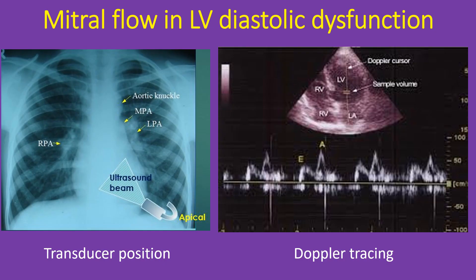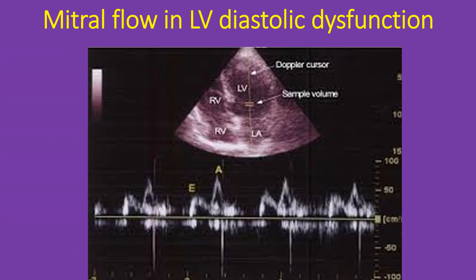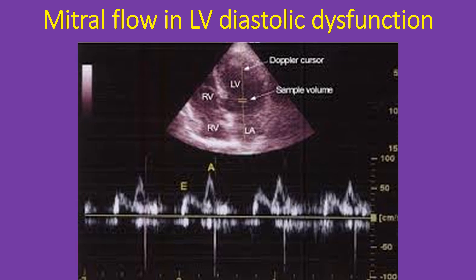Doppler interrogation of the mitral valve is usually done from the apex through the apical 4-chamber view. The transducer is placed directly over the apex beat and the echo beam is directed upwards. A good 4-chamber view of the heart is obtained showing all 4 chambers and both atrioventricular valves. The Doppler cursor is then aligned along the long axis of the left ventricle passing through the mitral valve, and the sample volume is placed just distal to the mitral valve to pick up flow in the left ventricular inflow.